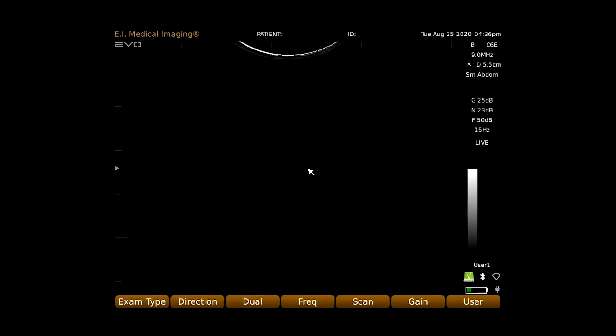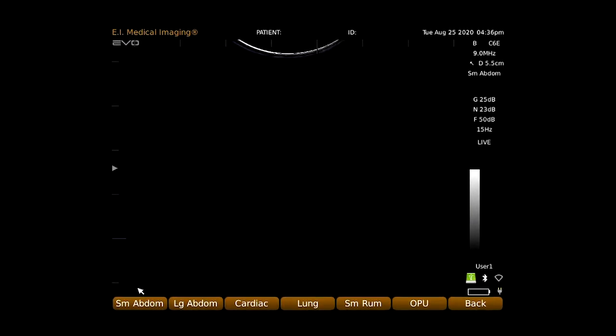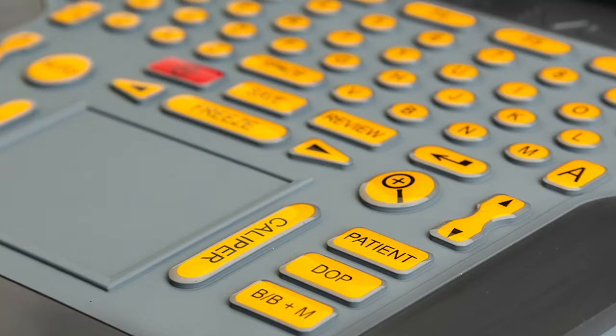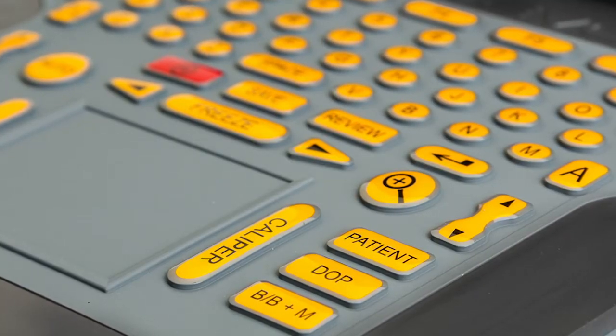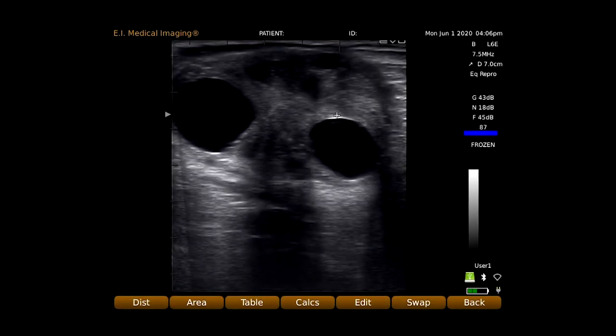Use our factory default, probe-specific exam types, or create your own user settings. Adjust depth, frequency, gain, and focal zone directly from the keyboard, and use the track pad for quick linear and area measurements.